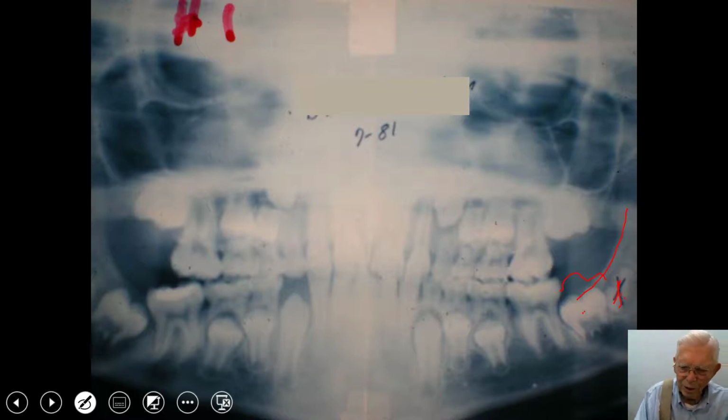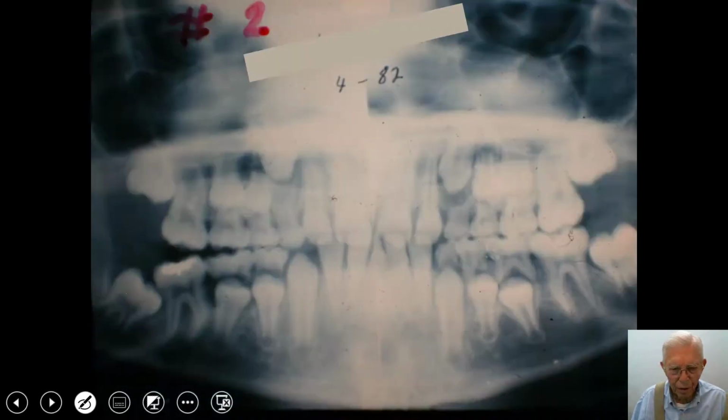Now, this is one of the few cases we've got where we've got a second molar here, and you see this molar is setting like that, and that's a pretty bad angle, and it's pushed on this molar as it was forming and pushed the crown over, and the roots are kind of tapered back to the back here. So we've got something obviously wrong in here.